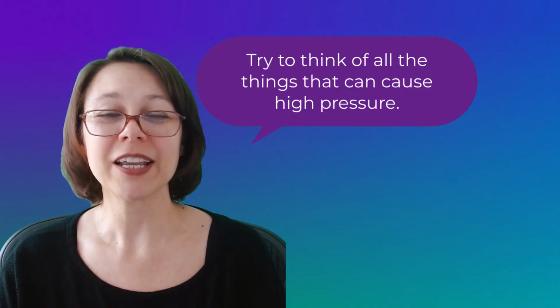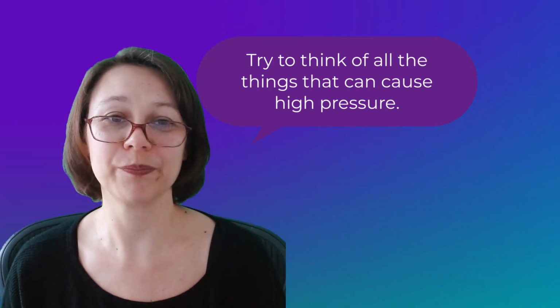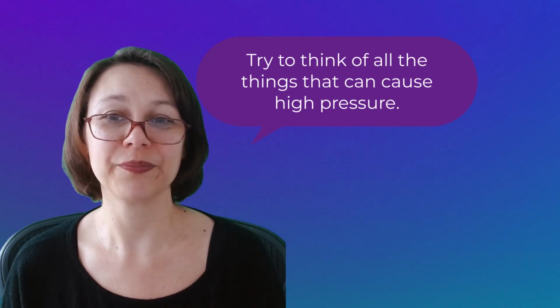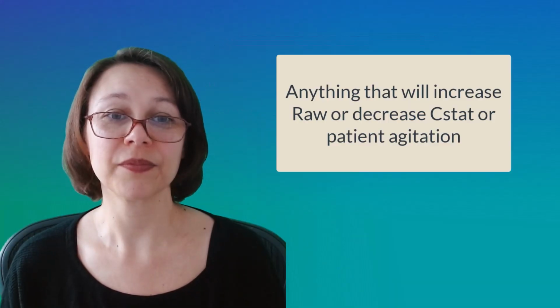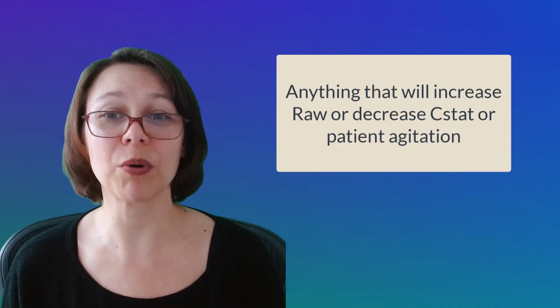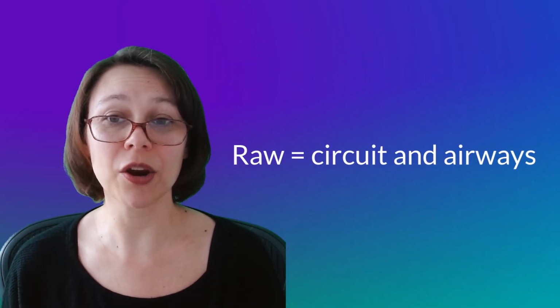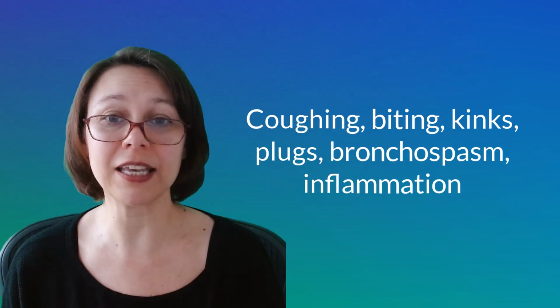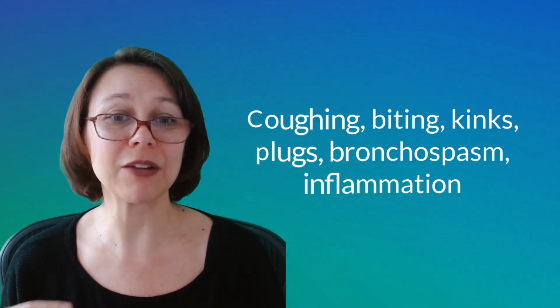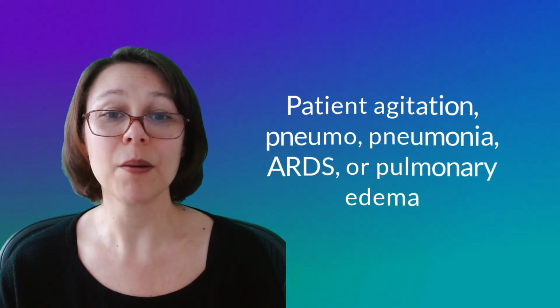Question 10, here I want you to try to think of all the things that can cause a high pressure alarm. You're looking for anything that will increase airway resistance or decrease compliance. Airway resistance will be anything in the circuit or airways. Compliance can come from alveolar issues or something that is pressing against the chest wall. It could be coughing, biting, kinks, plugs, bronchospasm, inflammation, patient agitation, pneumothorax, pneumonia, ARDS, pulmonary edema.